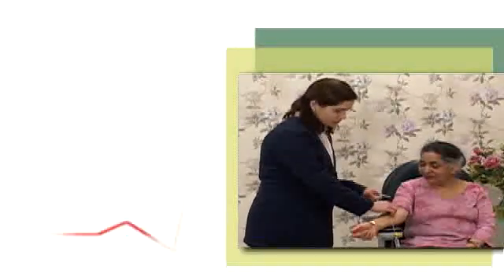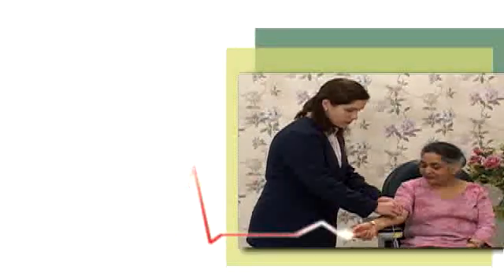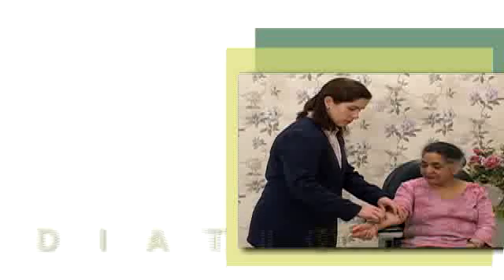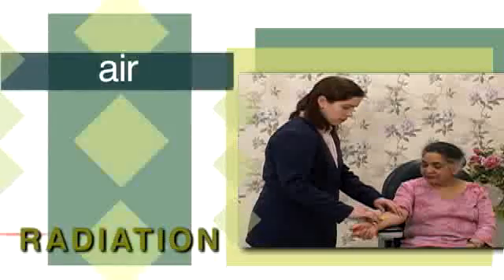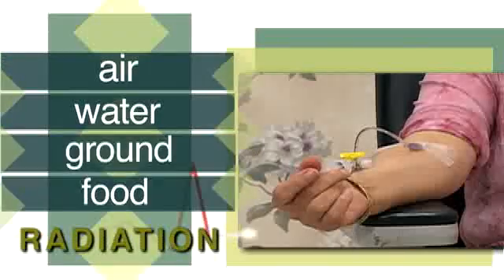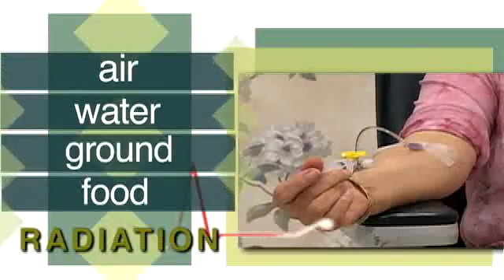The radiation exposure from the Cardiolite is comparable to the radiation you are already exposed to from the naturally occurring radiation in air, water, ground, food, etc.